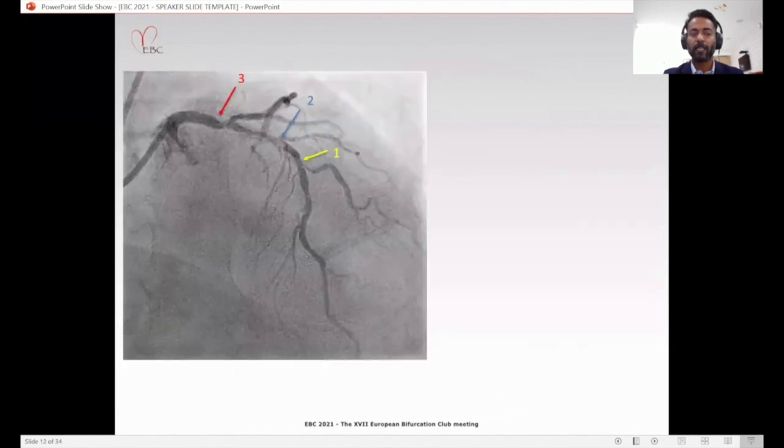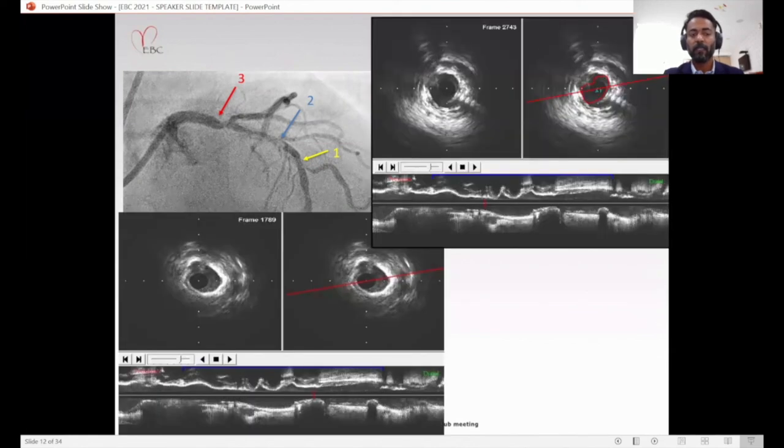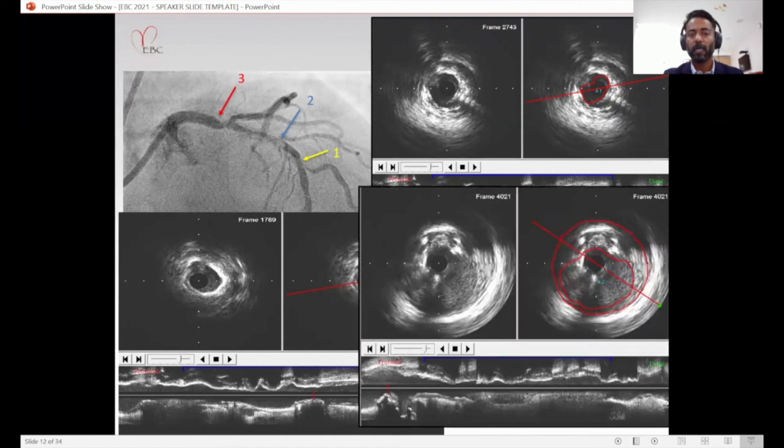On the IVUS, we had three points of interest: the distal LAD, the proximal LAD, and the distal left main. All around the LAD, we saw circumferential calcium, as we can see in point one, with an MLD of 2 millimeter and some rota effects from 6 to 9 o'clock. The calcium appeared thick. At point two again, we had thick calcium, which was circumferential, and thick calcium from 12 to 6 o'clock. And in the distal left main, we had a calcified nodule from 11 to 1 o'clock with favorable wire bias.